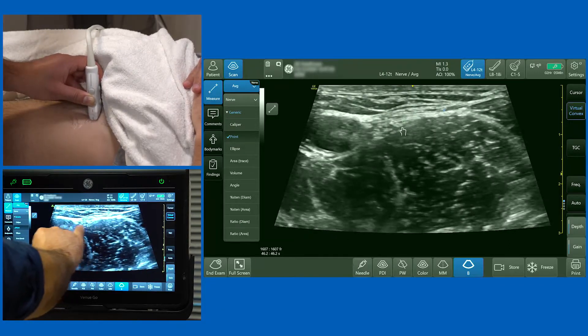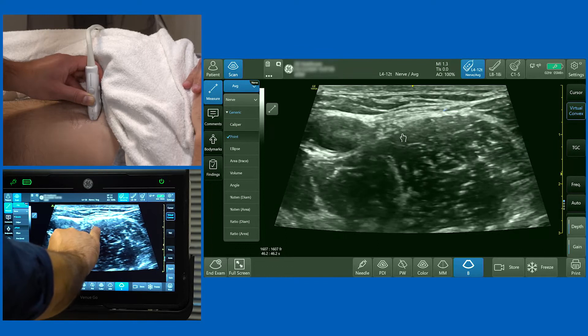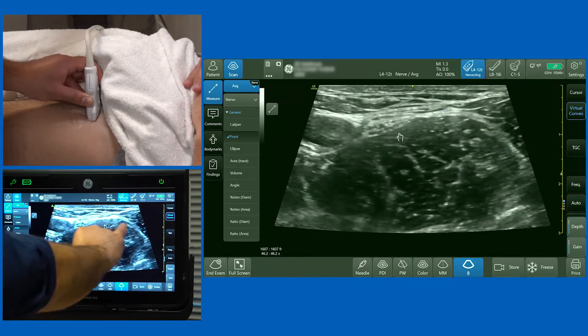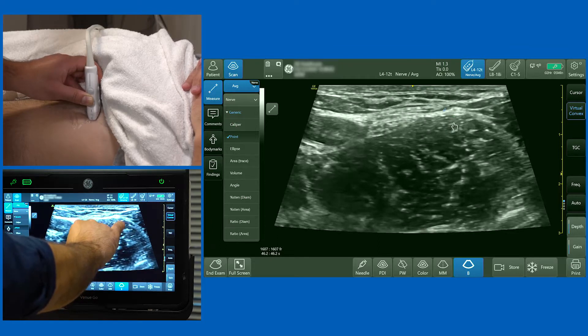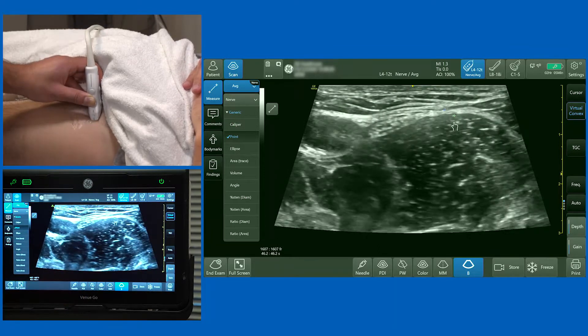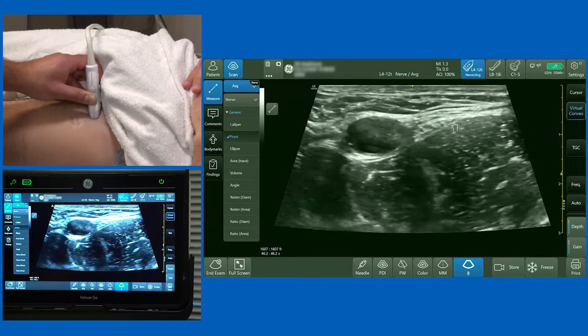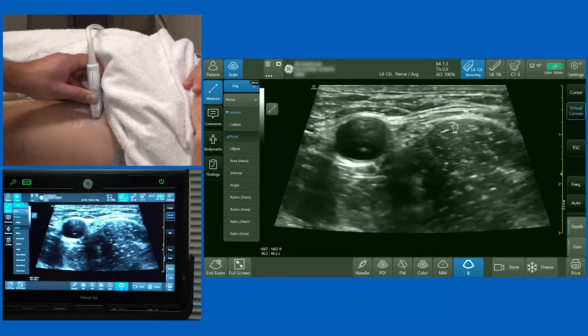If for whatever reason you cannot clearly visualize the femoral nerve — even though it's beautifully demonstrated here on the surface of the muscle — one way around it is to deposit your local anesthetic below the fascia iliaca and above the surface of the muscle. The local anesthetic will then diffuse towards the nerve.